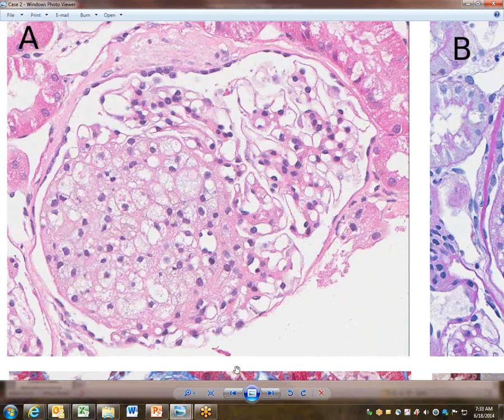Sounds good. Excellent. Okay, so in the H&E, what jumps out is segmentally the tuft is distorted by this aggregate of highly vacuolated, kind of variable size vacuoles within these cells. Who these cells are, I don't really know. And in some cases, nuclei appear nice and central, and in others, they're peripheralized by these vacuoles. Around the periphery of that aggregate, though, I think the capillary lumina are still open, and you can make them out, and they've got nice thin walls.